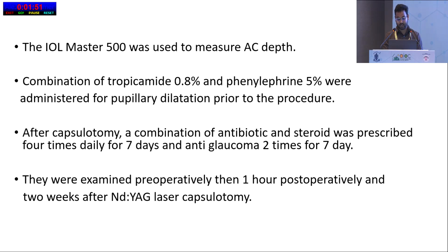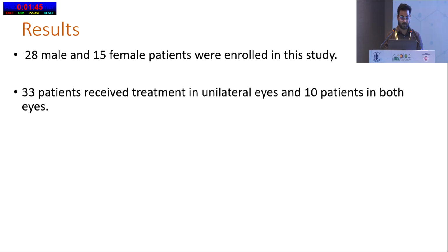They were examined pre-operatively, then 1 hour post-operatively, and 2 weeks after the capsulotomy. The result: 28 male and 15 female patients were enrolled in this study. 33 patients received treatment in a unilateral eye and 10 patients in both eyes.